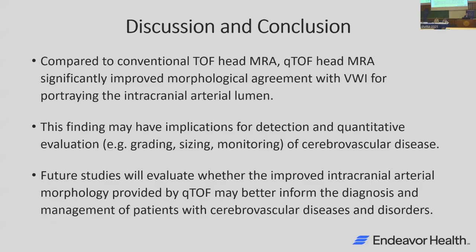Yeah, first of all, we didn't observe much flow artifact in our scan, so I think that needs to be clarified. We didn't inject any sort of gadolinium, which makes these artifacts more prevalent. We are looking at possibly correlating our results, especially in arterial stenoses or aneurysms, with DSA, but that wasn't the focus of this study, but definitely could be done.